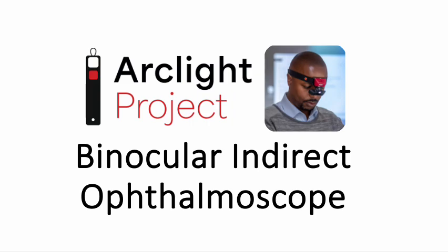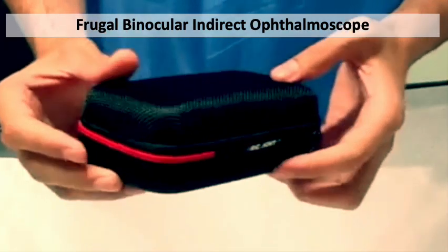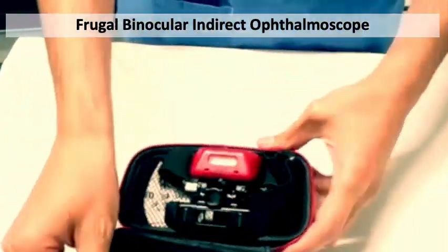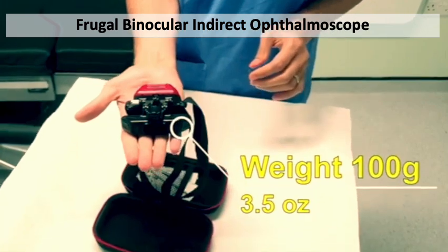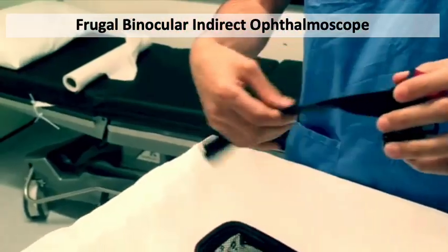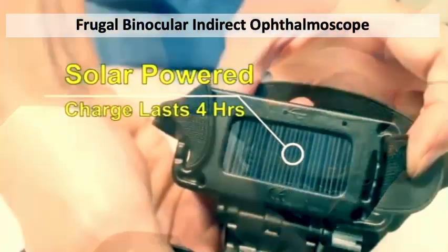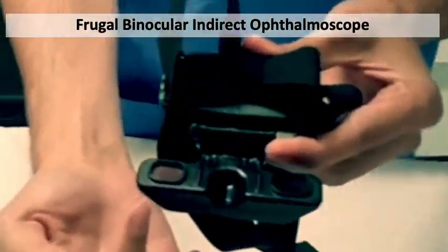And that brings me to the second device that we hope to release this year, and that's an inexpensive, simplified, solar-powered binocular indirect for ROP screening. The device is very compact and light with a simple elastic headband, and similar to the Arclight direct ophthalmoscope is also solar-powered using LEDs as the light source.